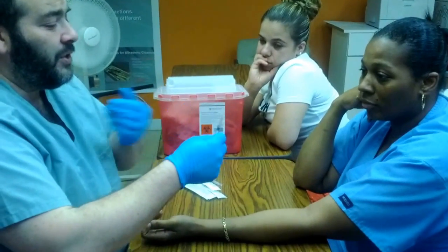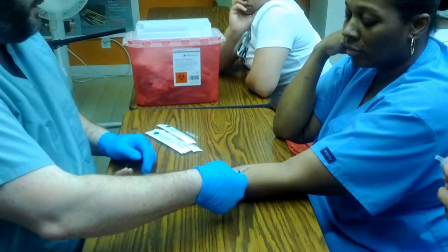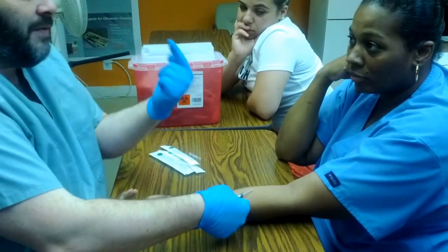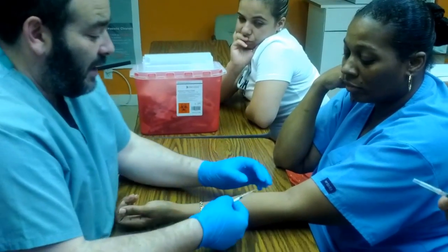The bevel of the syringe is to be facing you. If I lay it down on your arm just like this, the bevel is going to be facing up. All injections are done with bevel facing up.